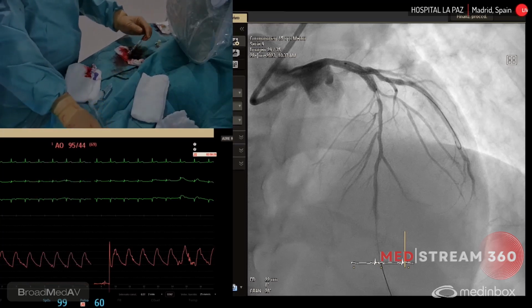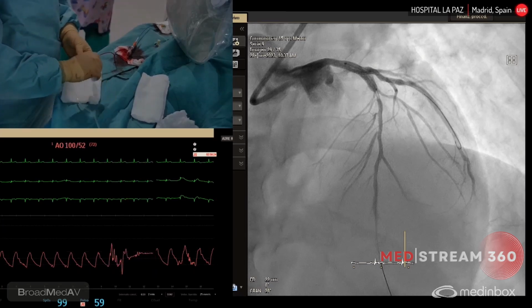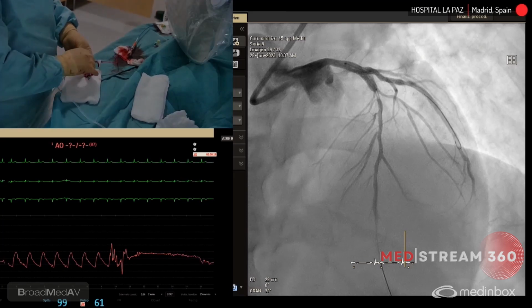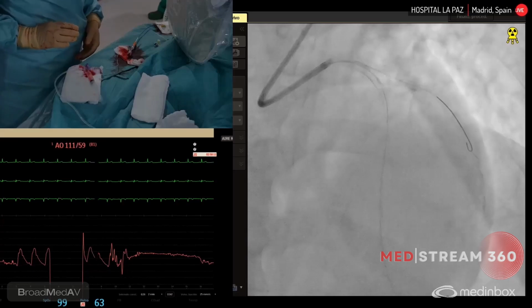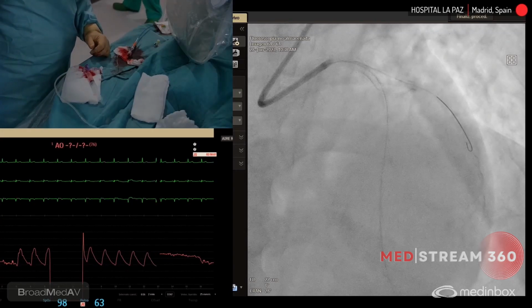Okay. Probably the plaque is similar to before, but you see the fixed proximal part. I think I told you before, probably we need to fix it. We can do IVUS if you want, or I think we can do the POT after IVUS, and we decide. We can check the POT result and save one step.